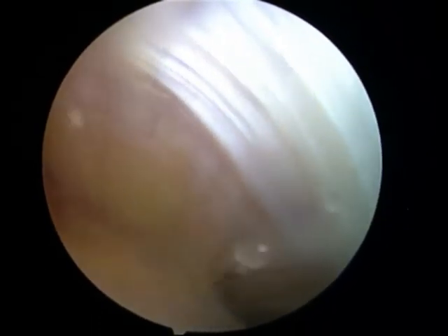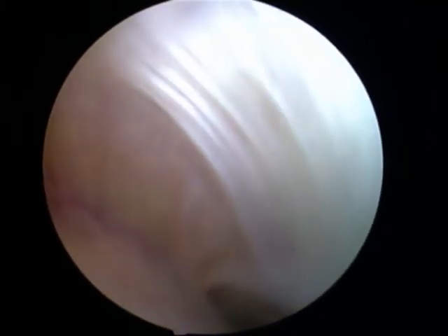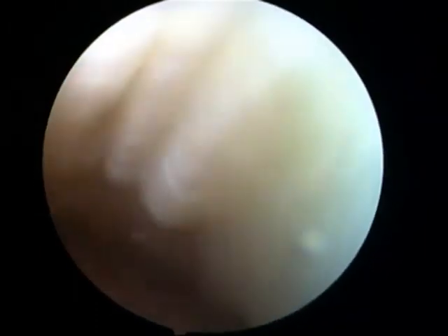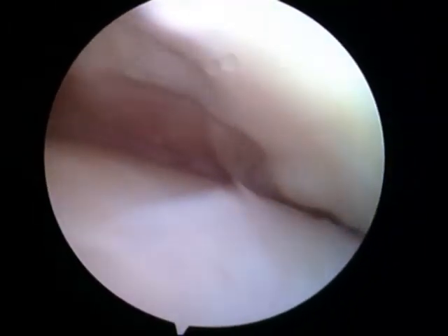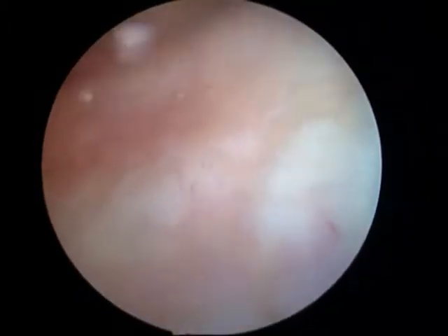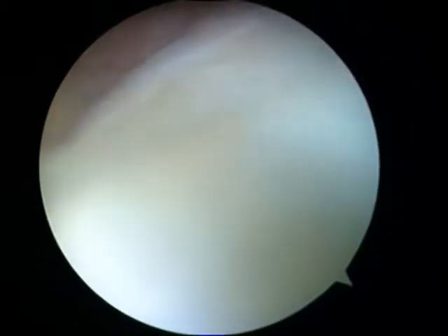This is my knee surgery that I had the other day. As you can see, just going in here — I don't know exactly what I'm talking about but I'm going to try and fill it in as best I can. At the moment he's going in under my kneecap — that's my kneecap there up the top, that white thing. He's just going to flush it out with some fluid, and he's looking around, going around the corner of my knee.